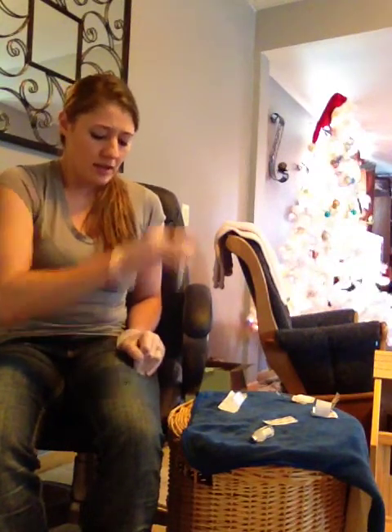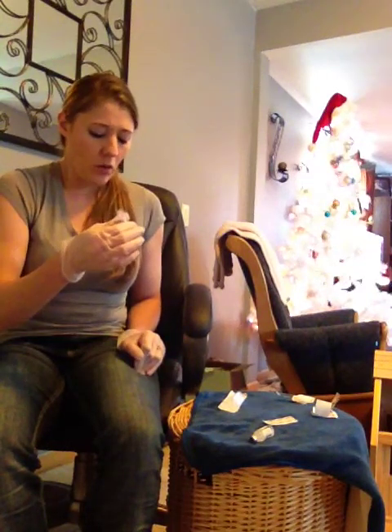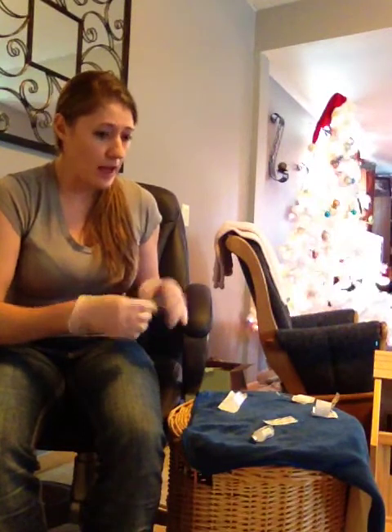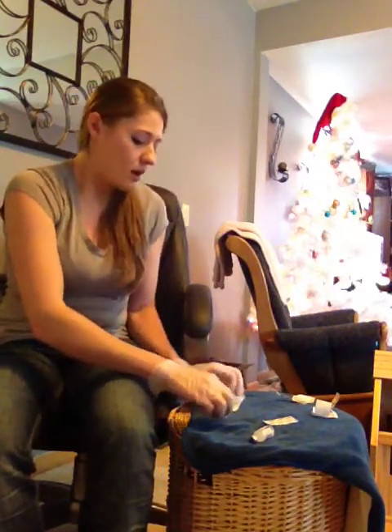And 10 seconds is a little long to wait, but you can talk to the patient a little bit, and explain to them that it's just about done, you're just about ready to take out the needle. So we're going to take the needle out, and we're going to hold about 3 seconds after the removal of the needle, and then we're going to release. Now, after that, we're going to discard this into a sharps container. The point of the Z-track method is to be able to keep whatever you're injecting into the muscle in the muscle.